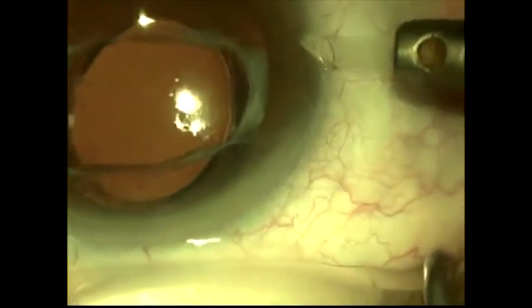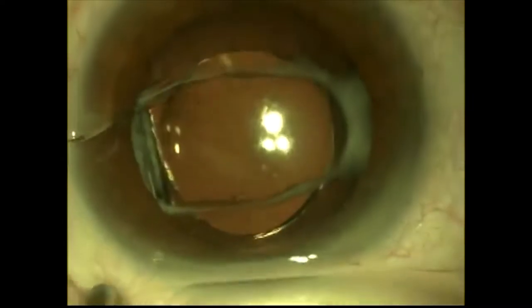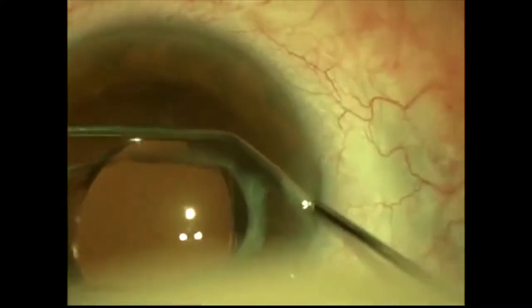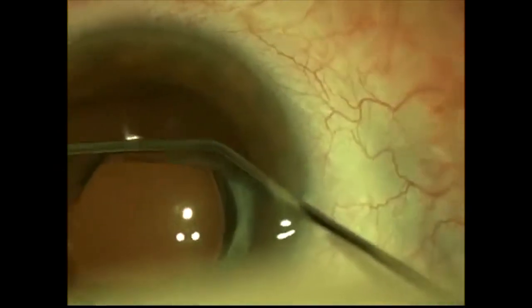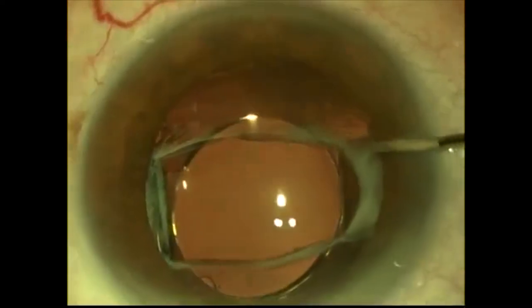With the crystal lens, Z-ing of the lens is quite bothersome and creates high astigmatism. Here we're making our primary incisions for entry into the eye in this Z-lens. This lens was so extremely tilted that there were four diopters of astigmatism and the patient's uncorrected visual acuities were 20/200.